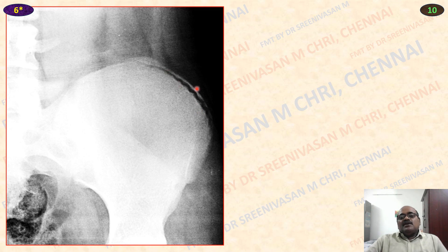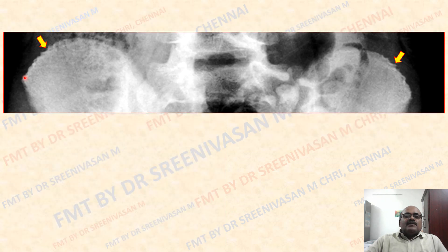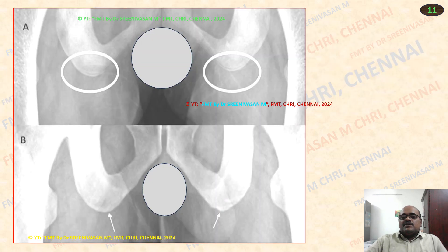If the iliac crest is not seen in the X-ray, we can presume it has not appeared. Here it has appeared and not fused. If it does not appear, the contour will look irregular and serrated. Here you can see the smooth contour — that means it has appeared, no serrated or rugged contour. Here you can see the irregular rugged border — that means iliac crest has not appeared, less than 14 years. The ischial tuberosity appeared, not fused: above 16, less than 21 years. Here appeared and fused means above 20 years.